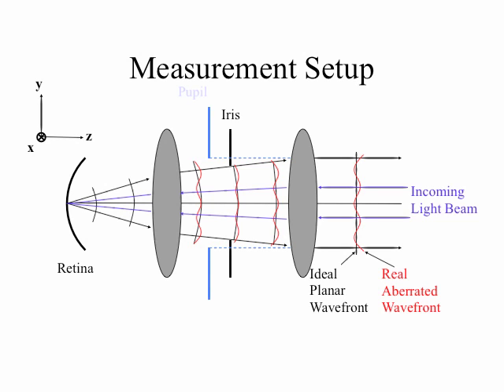We're going to move on to a completely different topic here, which is wavefront. We're moving out of the topography of the cornea, and indeed we're no longer dealing with the optics of just one part of the eye, but the optics of the entire eye. Now, those of you who have completed the optics course, the 20 lectures on optics, know how I discuss vergence.